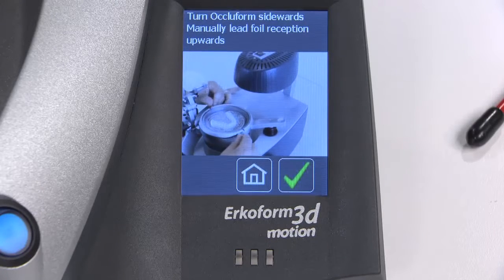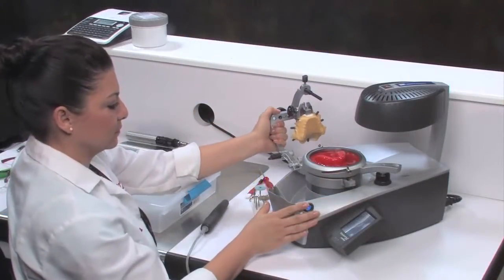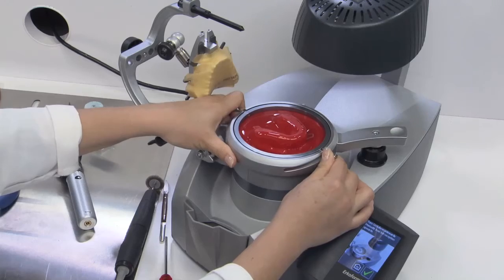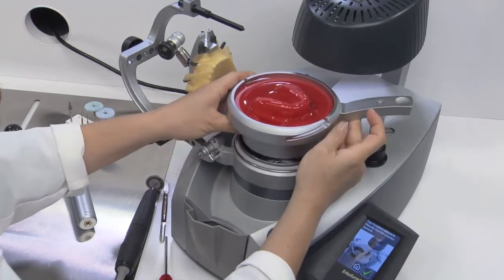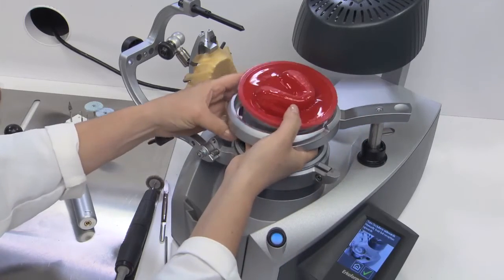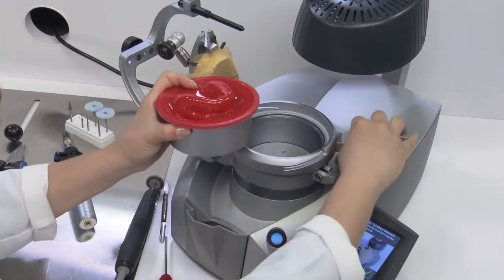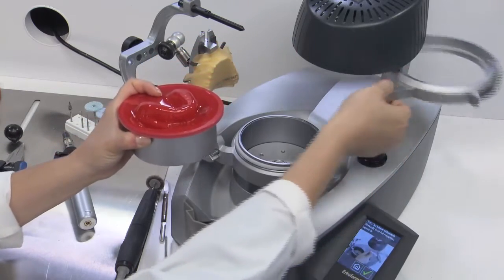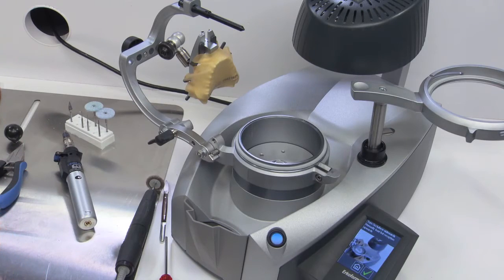After the cooling time has elapsed, the screen will instruct you to remove the Occliform. Remove the Occliform and the foil securing ring. Then, lift up the foil holder and remove the thermoforming pot and appliance. Once you've removed the thermoformed foil and model, reposition the foil holder by lifting and rotating clockwise until it locks into place.